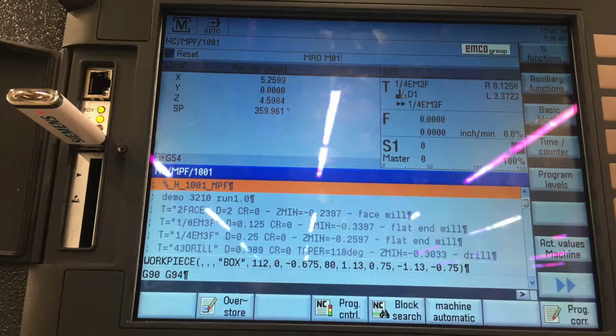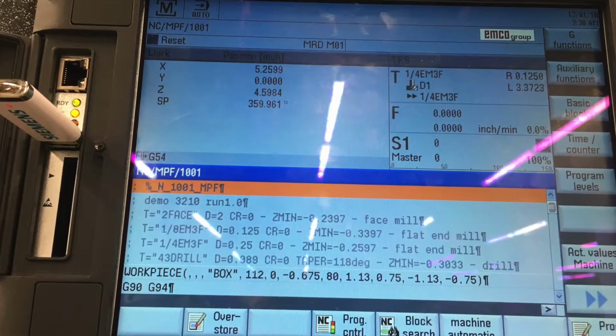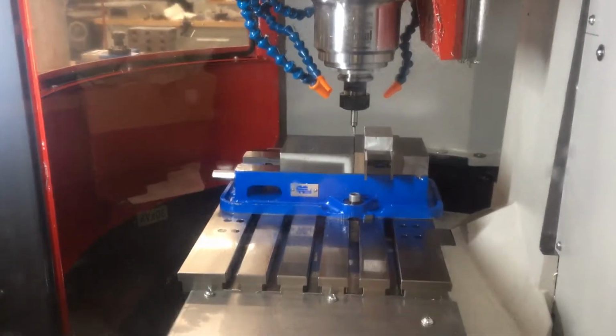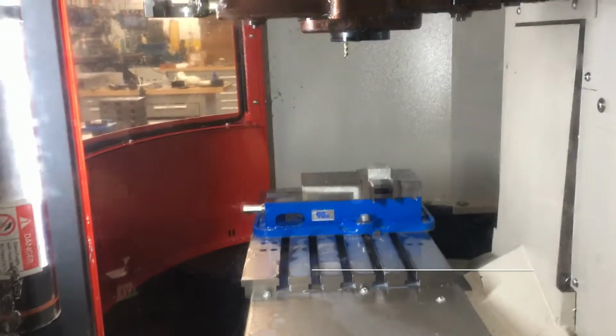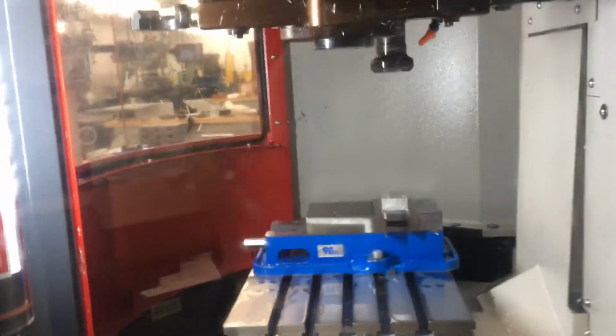G-code is generated from the CAM simulations and uploaded to the CNC system, the Sinumerik 828. This G-code consists of coordinate points that tell the CNC exactly where to go throughout the machining process. The programmed CNC machining process has 9 distinctive stages.